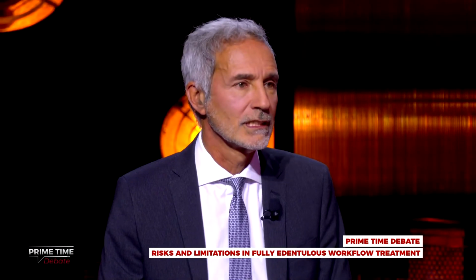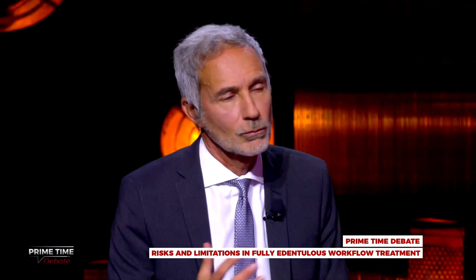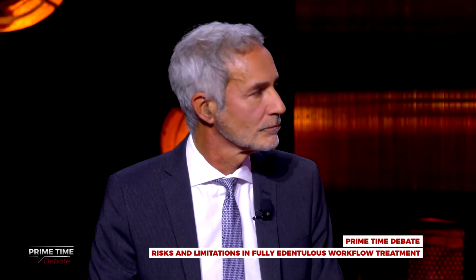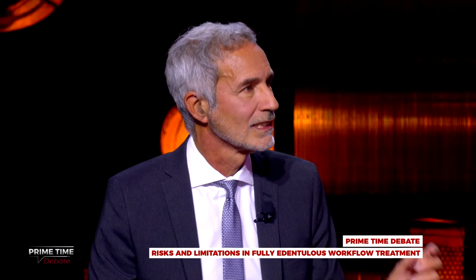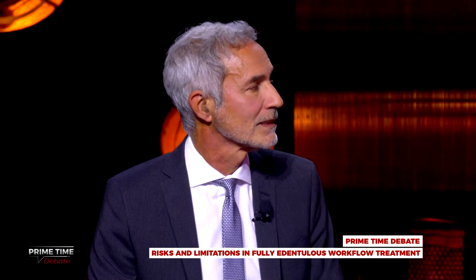It is a compensation that I like to do because I want to play safe and have a very passive fit of my prosthesis. Could you even call this cementation and not relining? Yes, I agree. Relining is not the right word because the space is very reduced, so it can be named cementation.